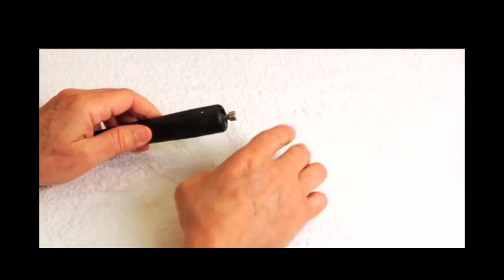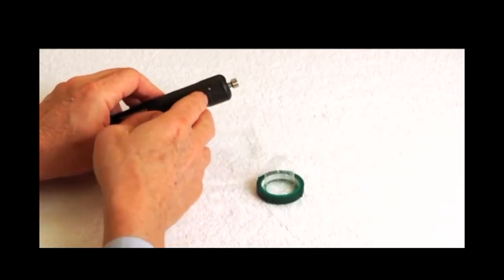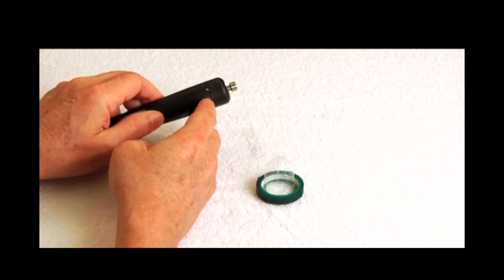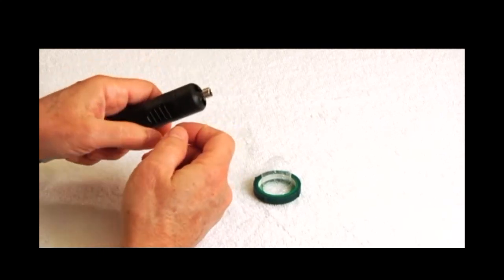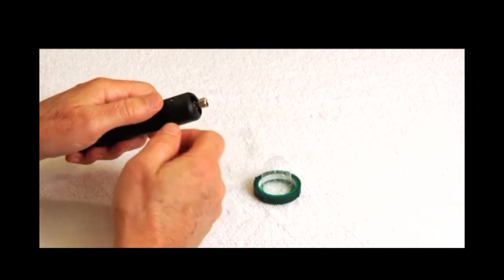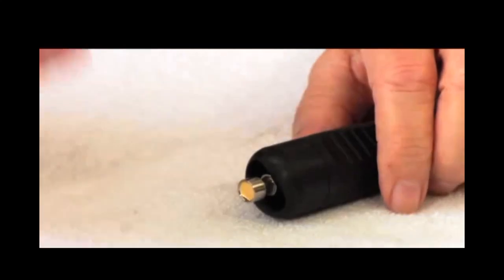In the situation where the ClearScan cover is pushed back onto this probe, where this parting line is, that can cause a leak. If you do notice a leak, I would get some type of stretchy adhesive tape like micropore and stretch it around here to cover that, and that will prevent leaks. Let's just fill this up.